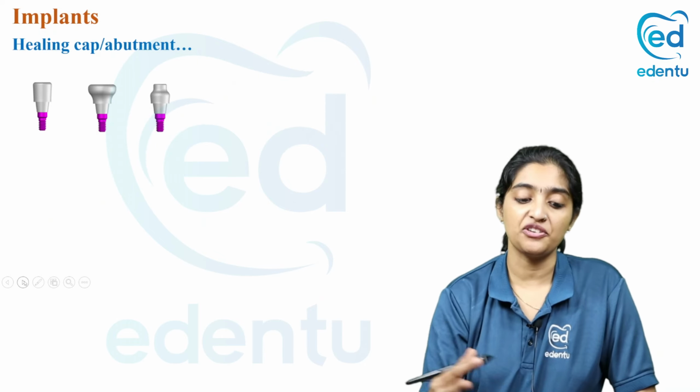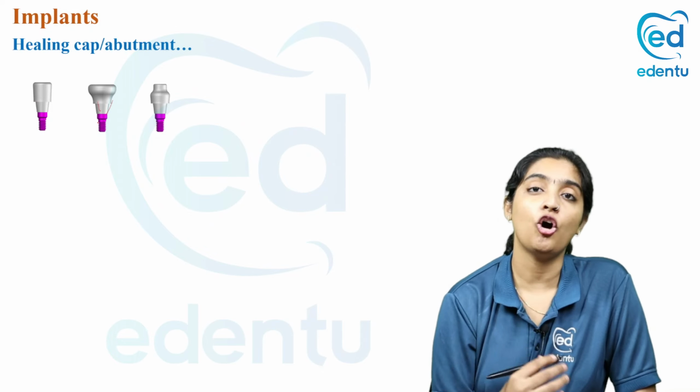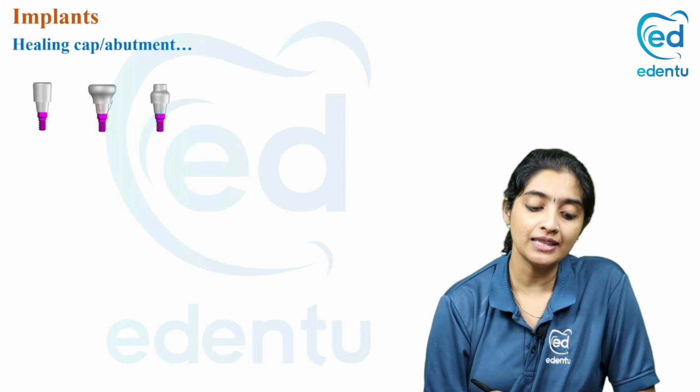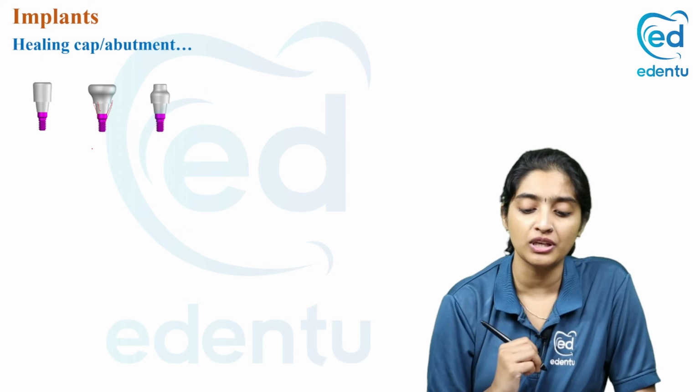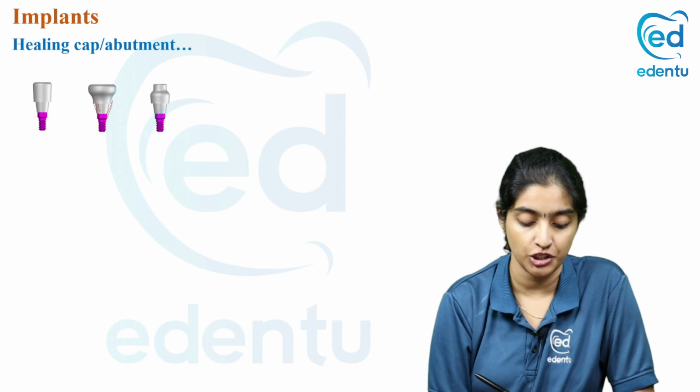So these are the different shapes. You have square, you have tapering, depending on your location. Especially in the anteriors, it is preferable to give tapering. Why? Because you need to get an emergence profile for your anterior tooth.